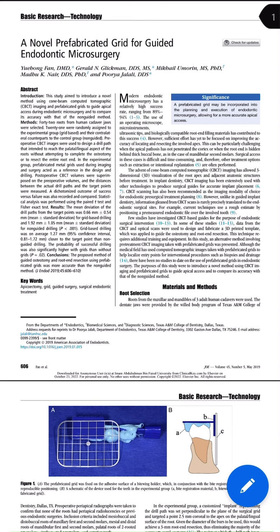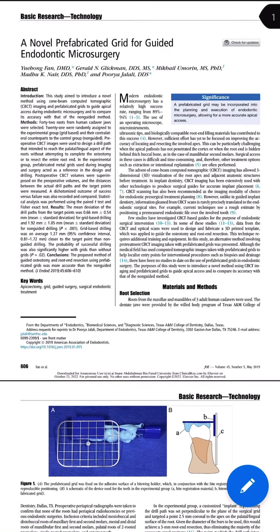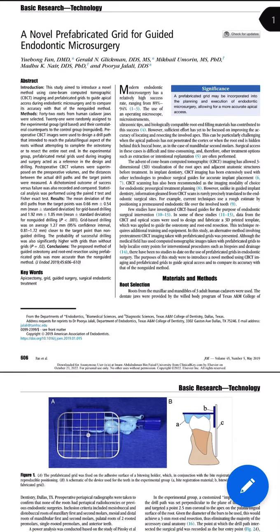However, with the many benefits of 3D printed surgical guides comes the issue of needing sophisticated equipment and expertise to run these equipment, such as the printers and the scanners, and also using the software to plan such a procedure. In this study, the authors are proposing a different approach where a prefabricated grid is used in the pre-operative CBCT.